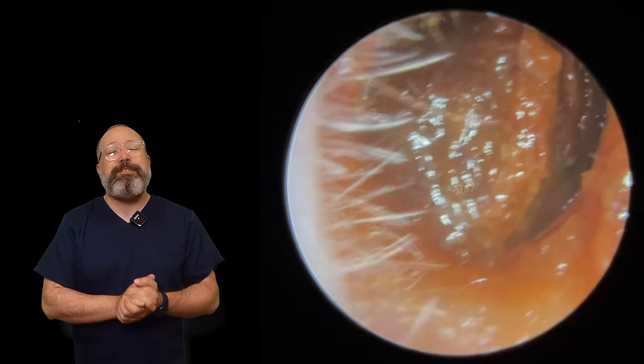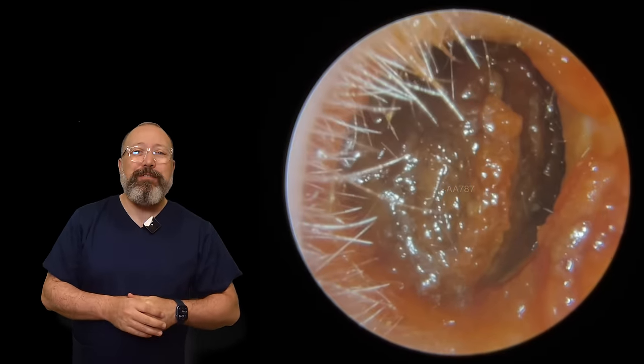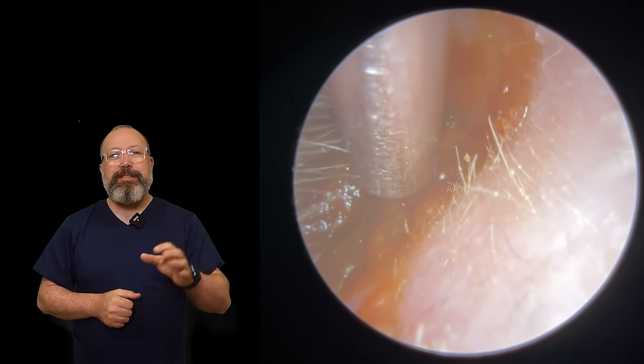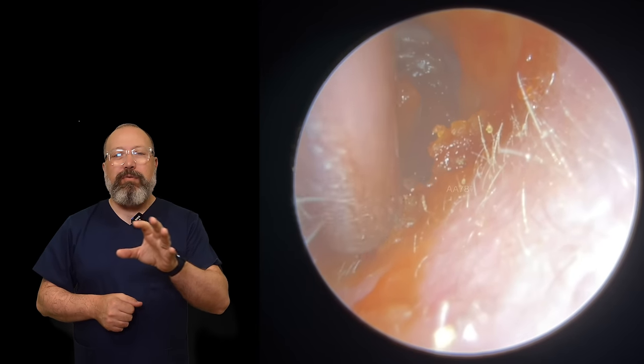Hi everybody, this is Rhys Barber from Audiology Associates. Thanks very much for watching this earwax removal compilation video today. Two patients in this compilation video.